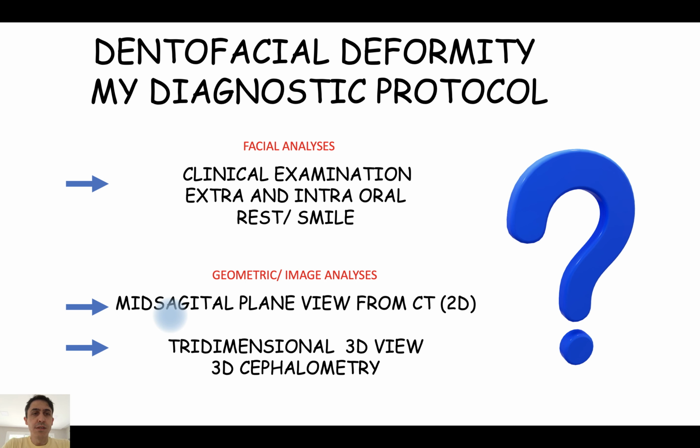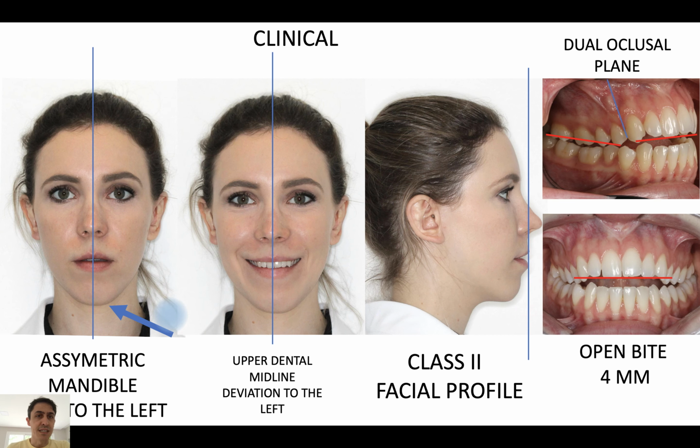In my diagnostic protocol for the analysis of the dentofacial deformity, I took into consideration facial clinical analysis with the patient in repose, rest, and smile. And I use some geometric methods to analyze the images to get important information about the diagnosis of the dentofacial deformity.